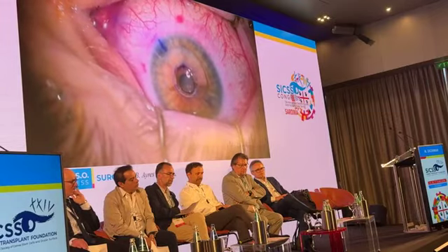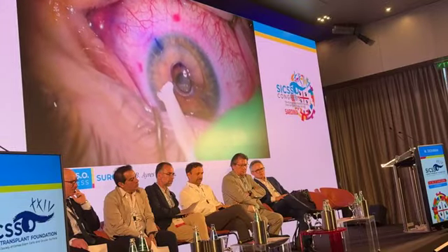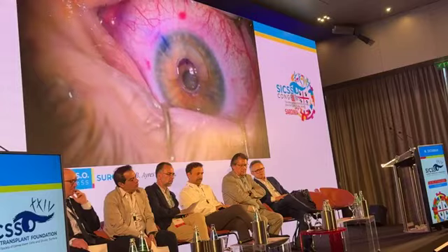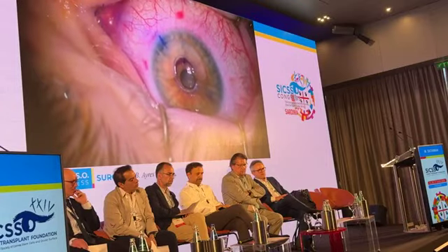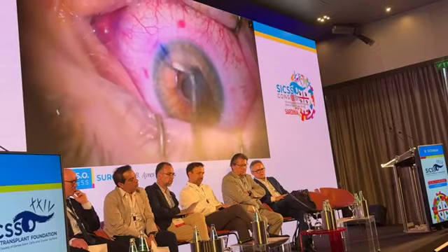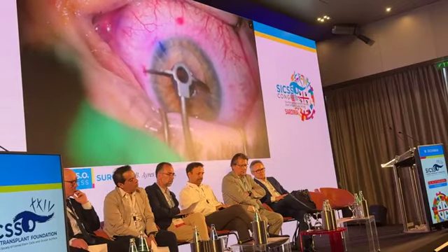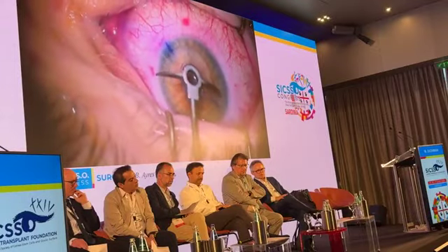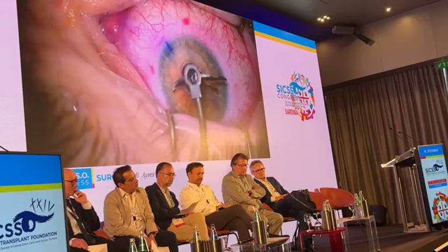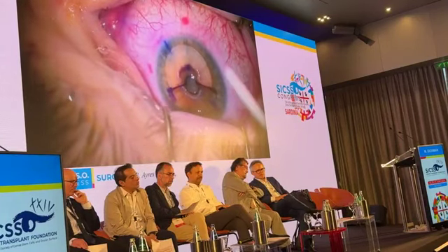I'm going to mark the approximate start and end points of the segment on the cornea, because the CTAC segment can scrunch itself up a little bit in the channel. So I want to make sure that we're fully extended. So I'll just use an LRI marker or a toric marker to put a mark here. This is 15 degrees away from our incision site, and then we'll put another mark here. And these are just approximate marks, so we know when that CTAC segment is all the way open.